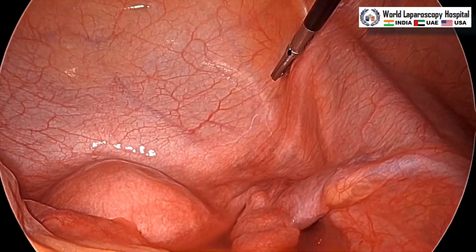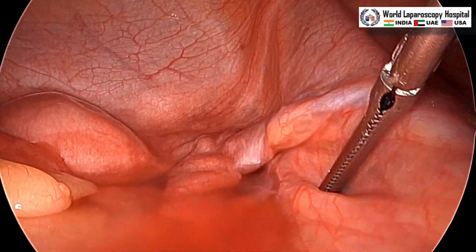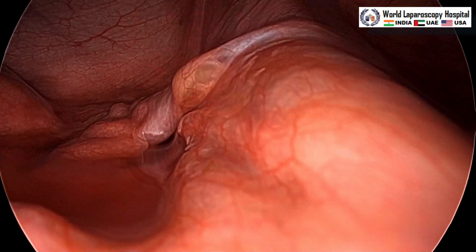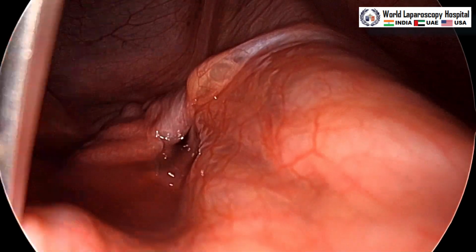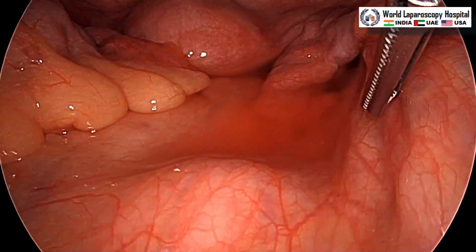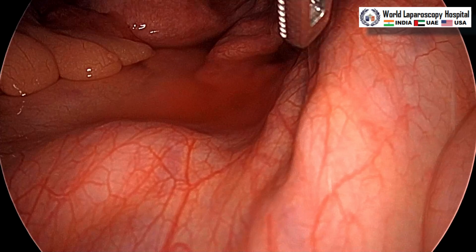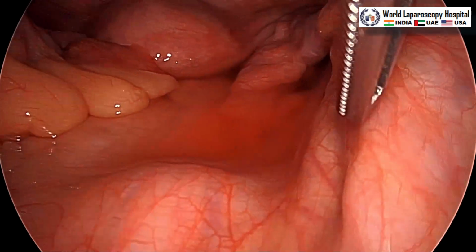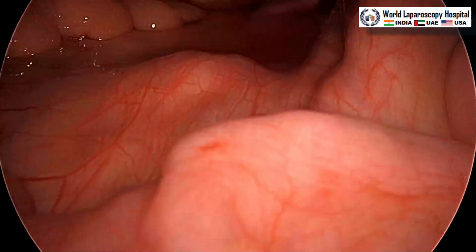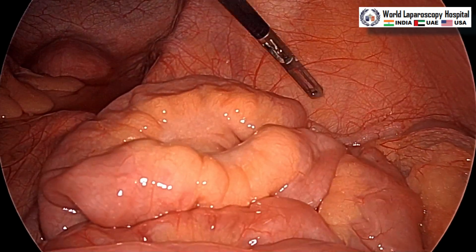So, this is the round ligament, this is the external iliac artery and vein, and here is the IP ligament, and this is the ureter. You can see peristalsis of the ureter, and just below the ureter is the internal iliac. This is the internal iliac, and this is the sacral promontory. So, anterior longitudinal ligament, this is the internal iliac, and here is the ureter. And here will be the bifurcation of the external iliac with the internal iliac, and the aorta is approximately 5 centimeters above the bifurcation, at the sacral promontory.